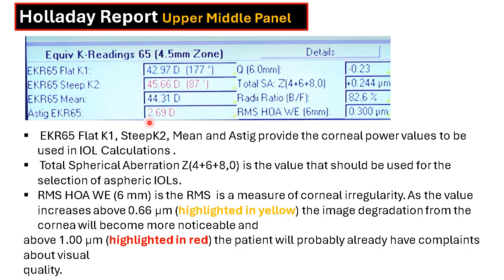They say that this power or this measurement is very useful in IOL calculation, whatever type of IOL you are using. And at that time, you don't need to have any A constant compensation for that IOL calculation. By the use of EKR 65, you don't need the A constant anymore. I will speak about the EKR 65 later on in another slide with more details.